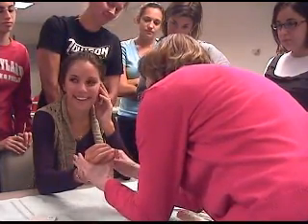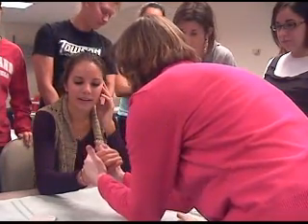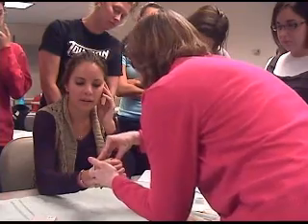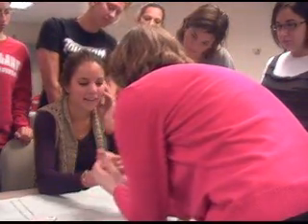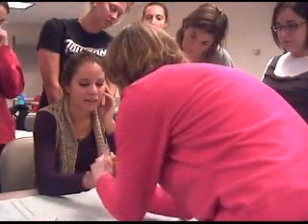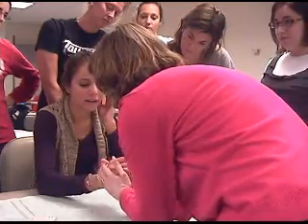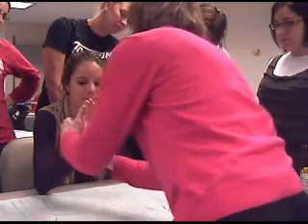Are you trying to mold them together? Yeah. I want it to overlap so that it doesn't pinch her. And there's that one. So it's up to the IP. It came a little bit too high in the back, so I just kind of rolled it down. Yeah, good point. Before it's set up completely, make sure they can. Because if somebody's got a large IP, and a lot of people with arthritis do, they're in trouble. Then you're using your bandage scissors and you're hacking the thing off of them. Okay, wave at me a little bit. Let's get this, extend your wrist up.